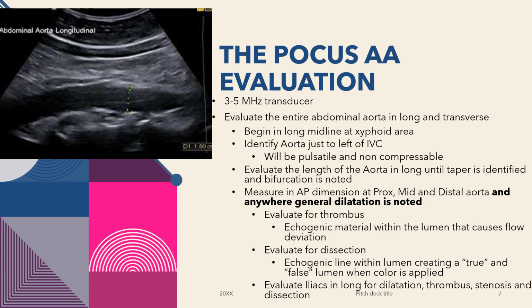The aorta is going to lie just left to the IVC. If you're having difficulty determining if you're in the aorta or the IVC, you'll notice that the aorta is pulsatile. The aorta's pulsatility can actually reference to a pulsatility of the IVC as it bumps it. So just be aware that you want to be careful to ensure you truly are in the aorta.